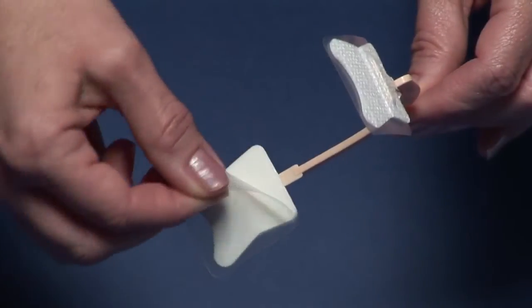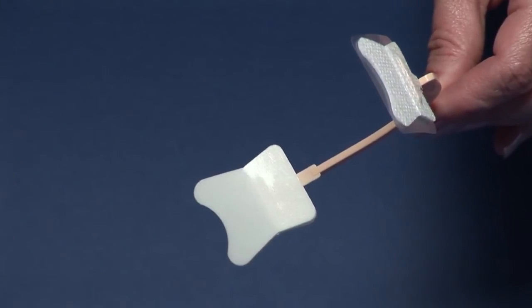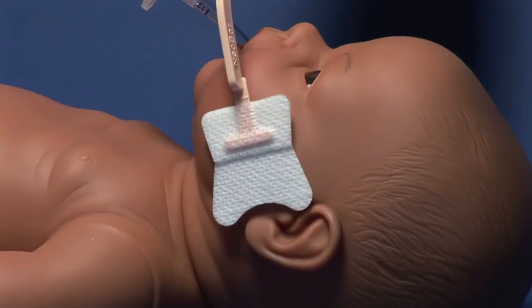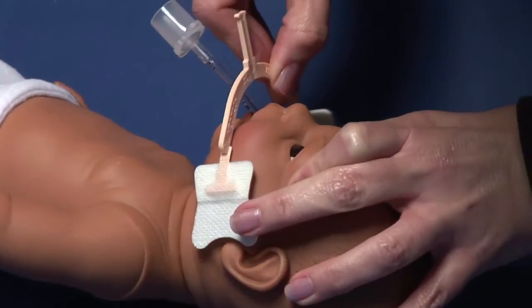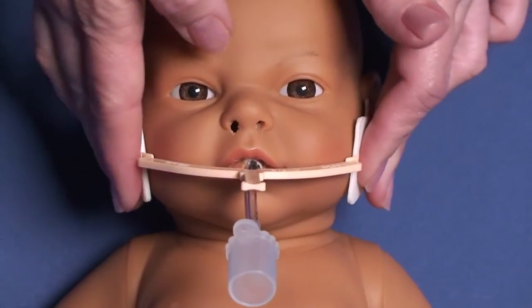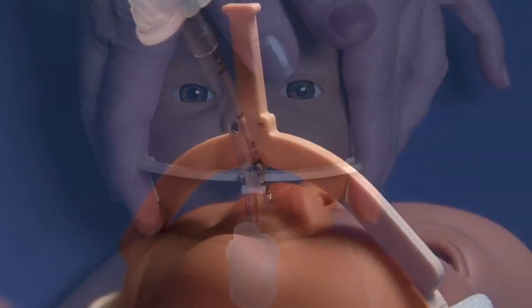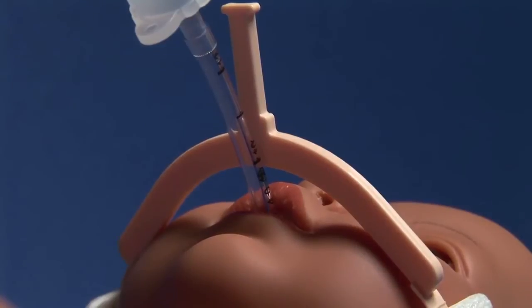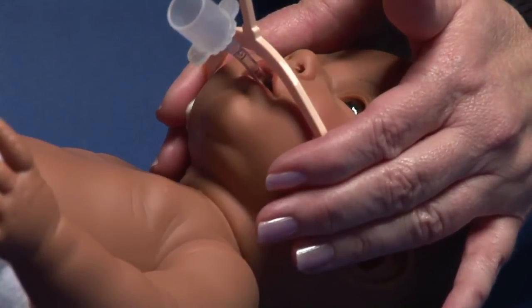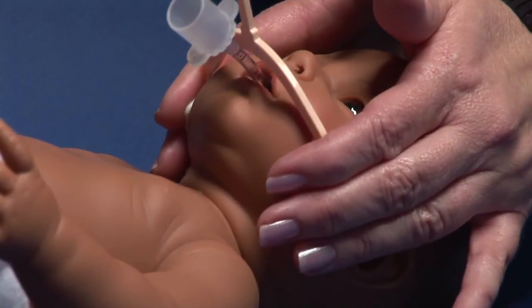Once the tabs are warmed, remove the clear liners. Apply the tabs over the bony process in front of the ear, where the skin is less mobile. Position the Neobar across the center of the mouth, between the upper and lower lips. Keep in mind that the Neobar and ET tube should not come in contact with the lips. Cover the tabs with your fingers and hold for 60 seconds to ensure proper adhesion.